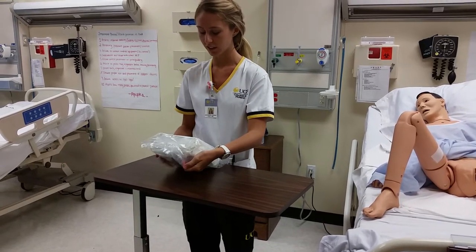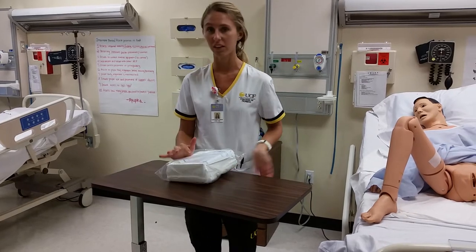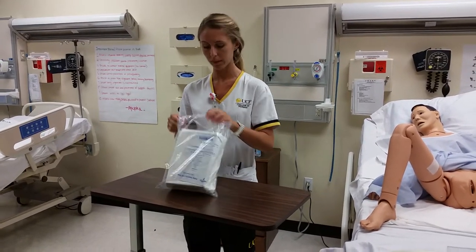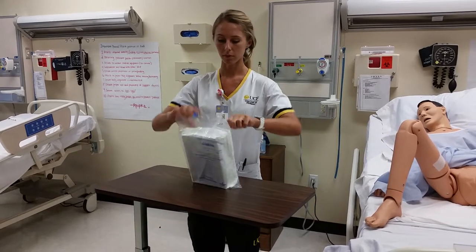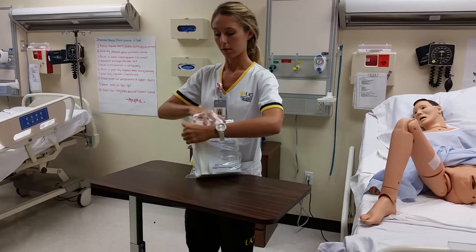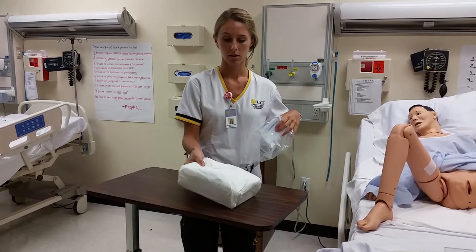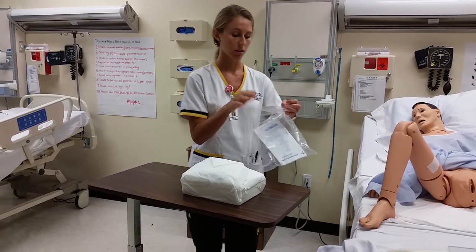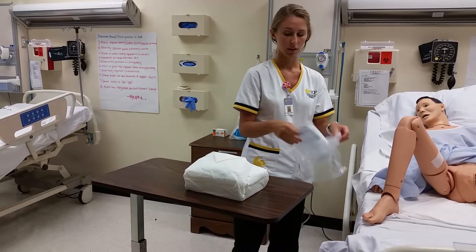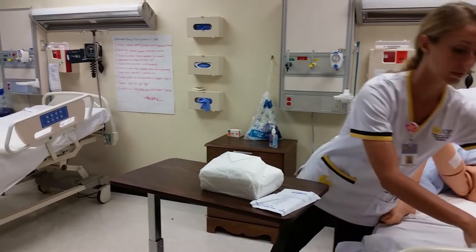So my package is intact. I'm checking the expiration date, that it's in date, and none of the contents in this our patient is allergic to. So I'm gonna go ahead and open this up. And place our kit on a clean surface. And I'm gonna go ahead and use the bag for my discard bag. And we're going to set this right here.